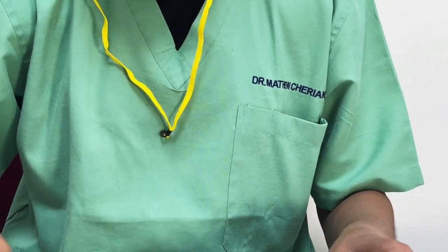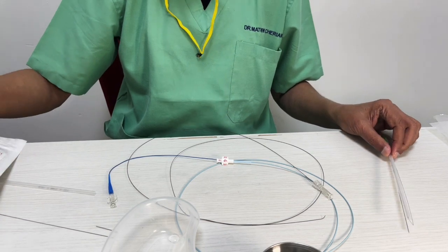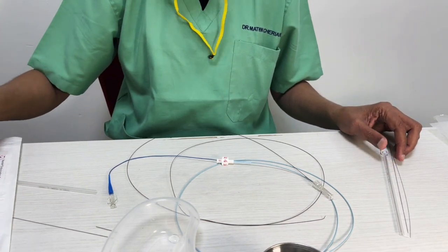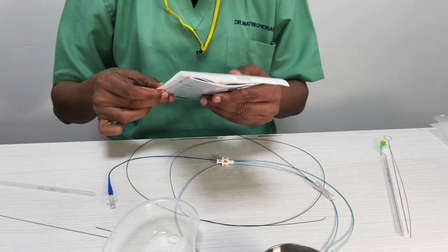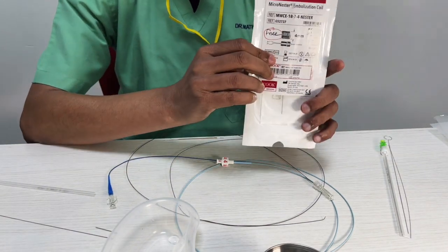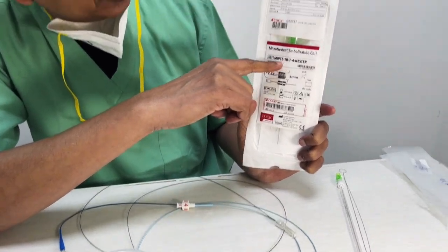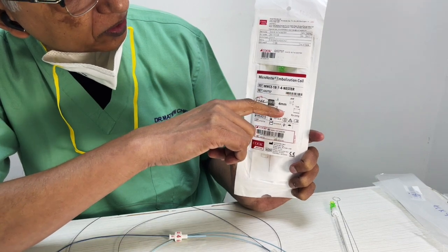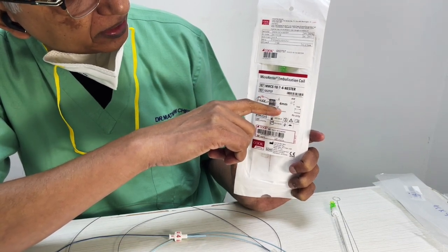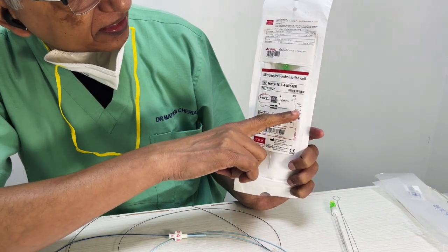So let me get you a 2.1 coil. If you look over here, you'll have this 18 written over here. That's important to see. So it's an 18, 7, 4 Nester coil. Basically the diameter out here is 4 mm and the length is 7 centimeters.